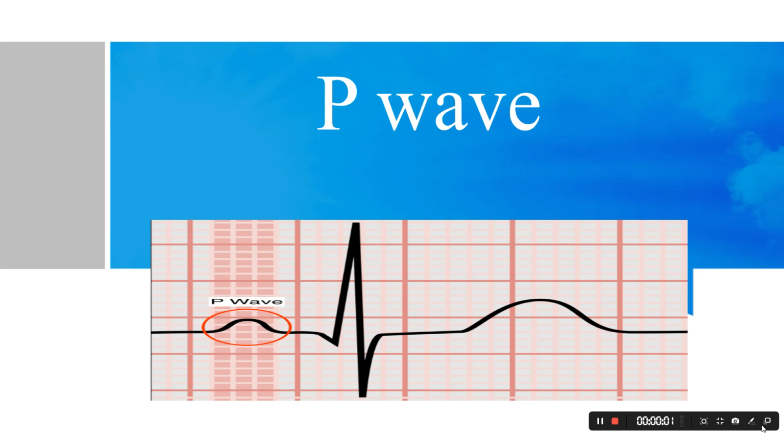Hi friends, in this series of ECG Basics, today I will talk about the P wave in the ECG.